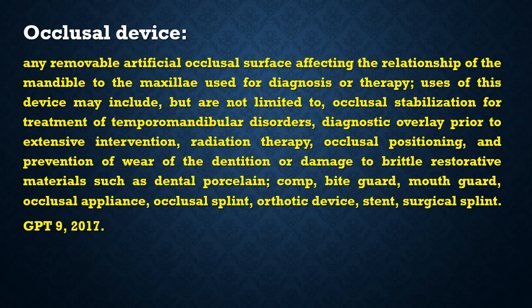Other names could be bite guard, mouth guard, occlusal appliance, occlusal splint, orthotic device, stent, and surgical splint.